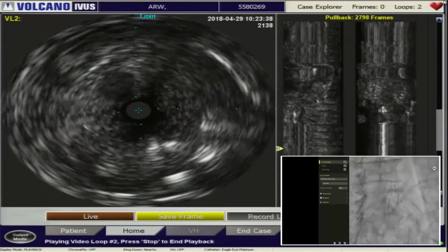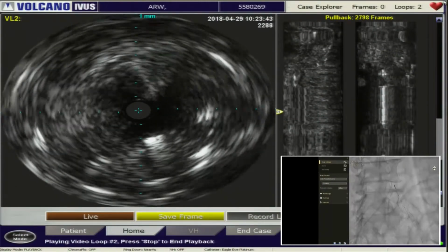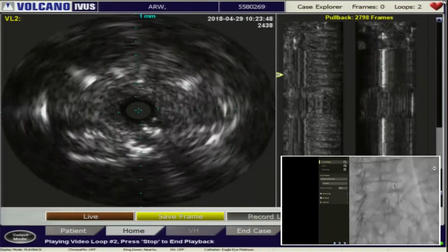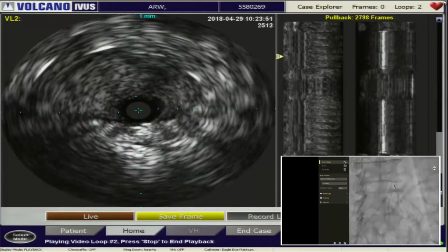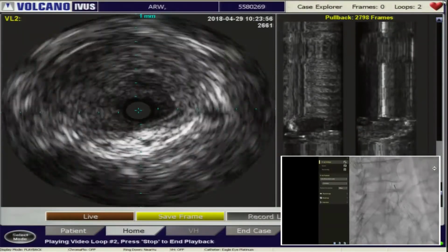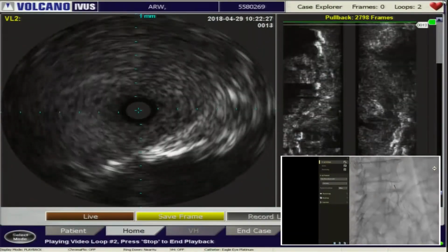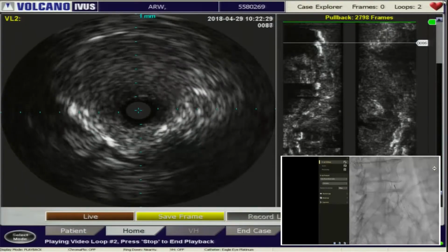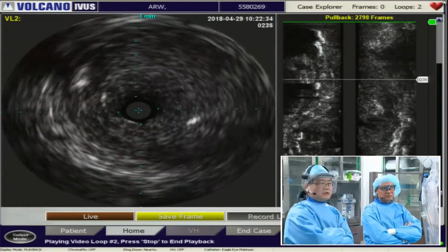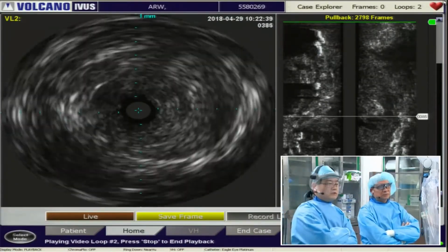Yeah, good. So it's a little the same area as the internal iliac artery bifurcation. It's this area. It's the most severely elliptical shape of the stent, but it's not compressed. Initially the expansion was not good, maybe due to the calcified plaques. So I think it's proper for some description of these regions.